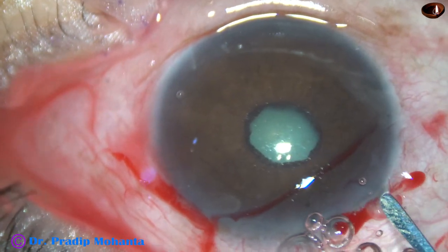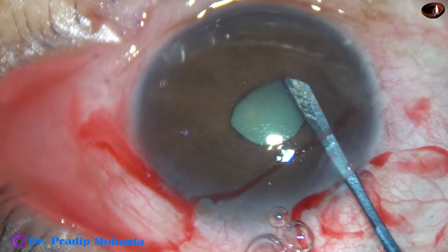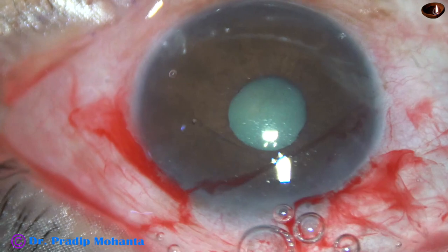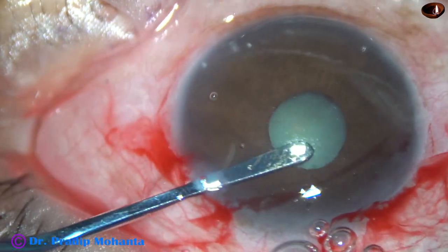I have injected viscoelastic — this is 2% HPMC. And now I am breaking the posterior synechiae with this iris spatula, breaking the synechiae all around.